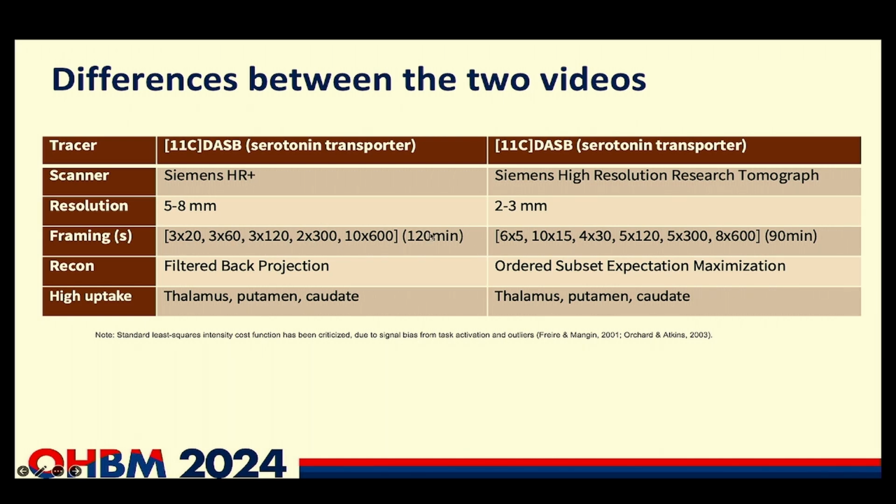The first scan was 120 minutes, whereas the other one was 90 minutes. And then what I just mentioned previously, the first one was a filtered back projection, and the second one used an iterative reconstruction algorithm, an ordered subset expectation maximization algorithm, to reconstruct the data.